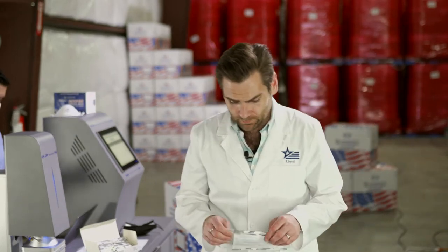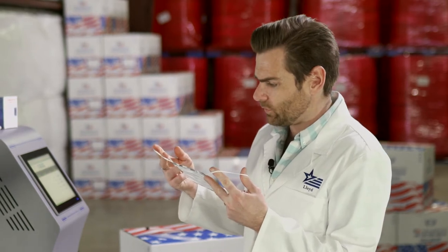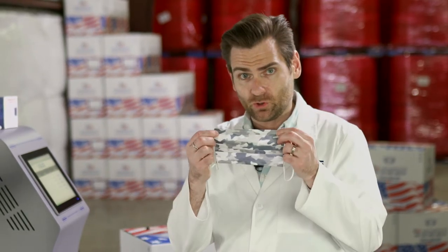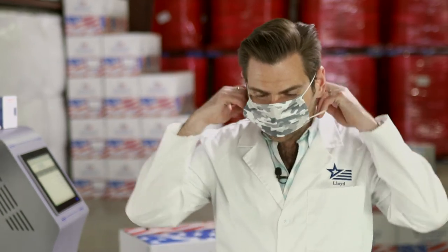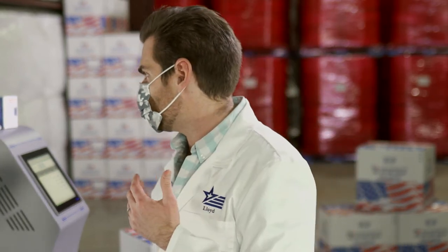We've tried their stuff before — they have great ear loops, they typically are pretty strong. The ear loops are a little bit bigger than we normally expect, but I love that even though it's a design mask, they put the welds on the front, which is great. Look at how big this is though.